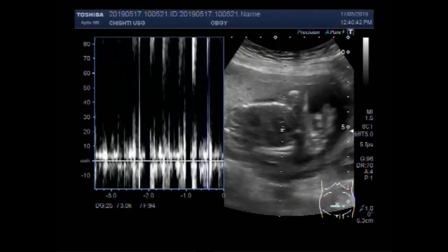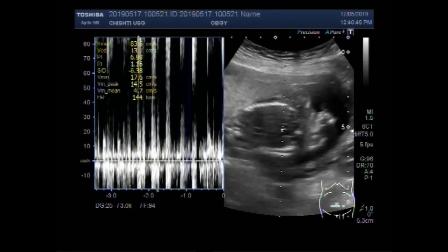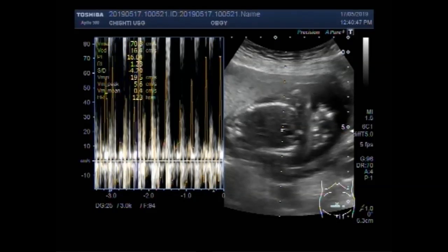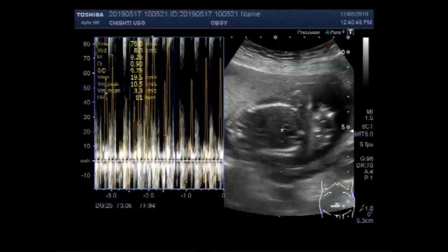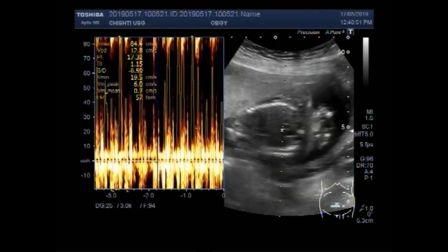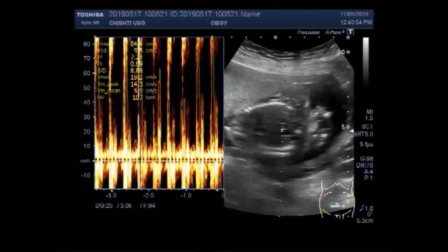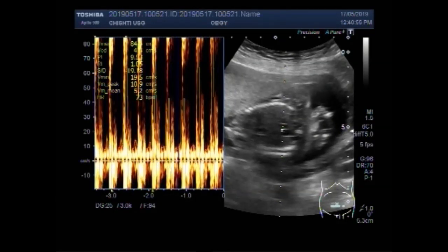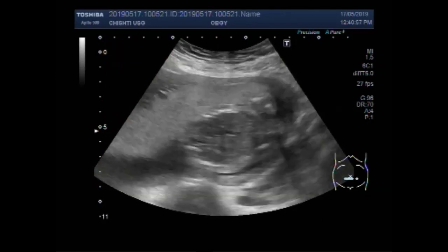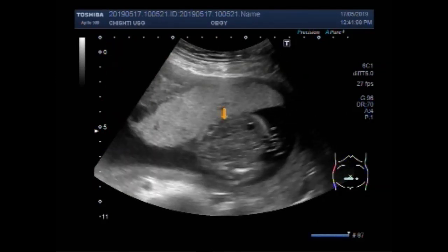Vital cardiac activity is visible and audible. You can see the placenta is anteriorly attached. This is the placenta.